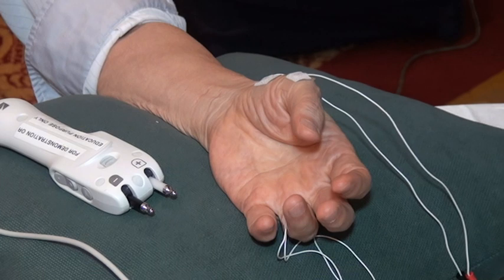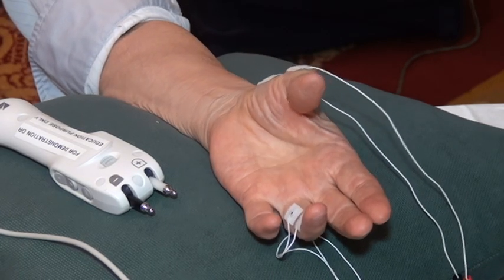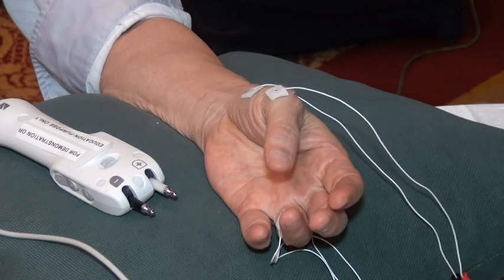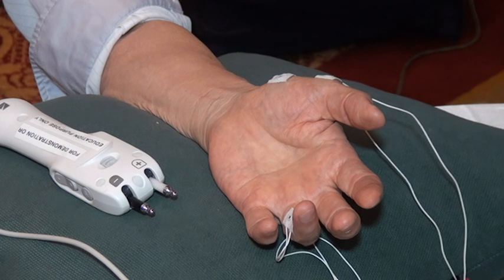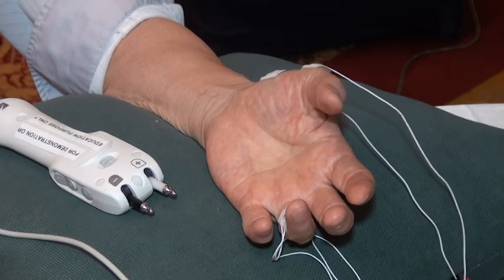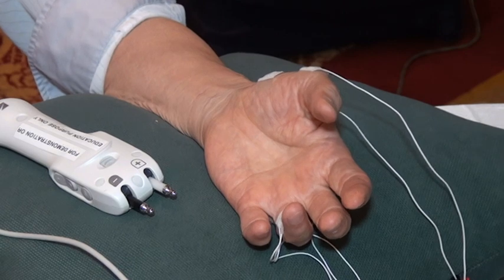I moved my muscle intentionally. This was that thing, and I moved it down, down, down, down. And so synchronization is different. Or this and this is a normal response, but the position of the thumb is different. One is synchronized, and the other is desynchronized.